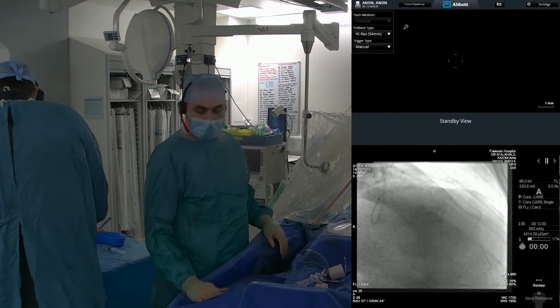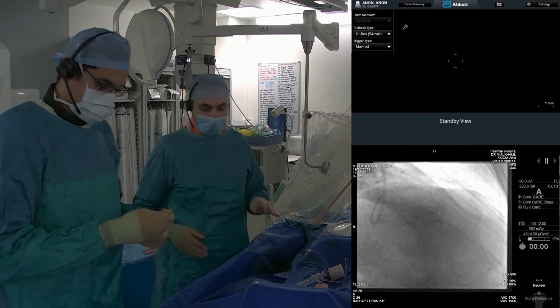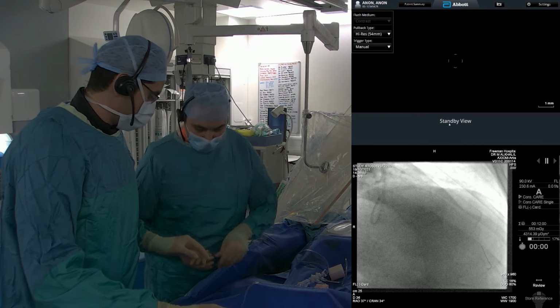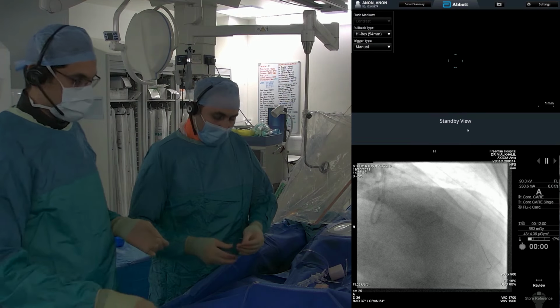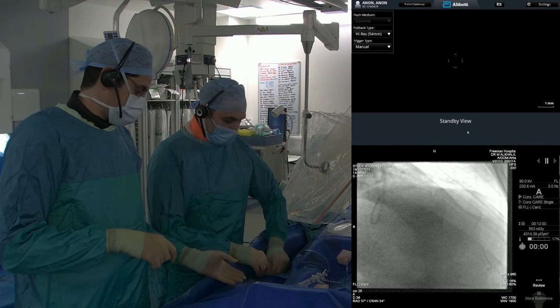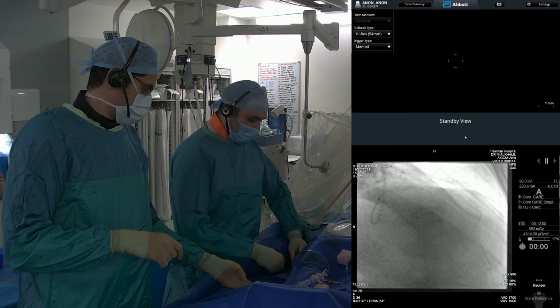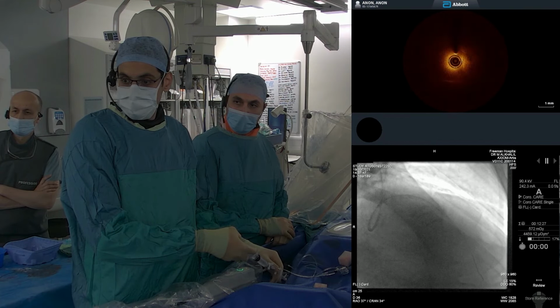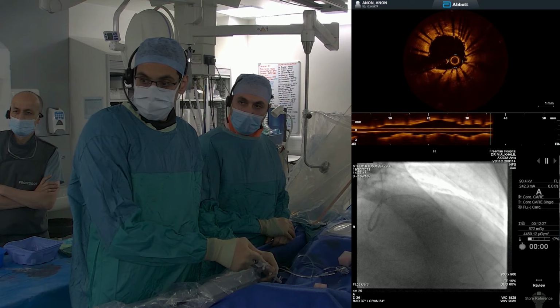It might be useful now to decide whether on the proximal side of the vessel you could go with a 4.0 actually and see. Yeah. Right. So that might be an option. I think it would also be useful to see what the stent within a stent, how the neointimal hyperplasia and neoatheroma looks. Absolutely. I think we may struggle just to clear the blood, but I think it's certainly worth trying. Go for it. And start pullback. Ah, it's a nice picture.